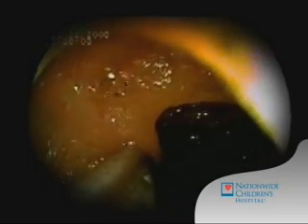Here we see a sample of the bile secretions inside the small intestine, which are the detergent that helps us dissolve and digest our food.